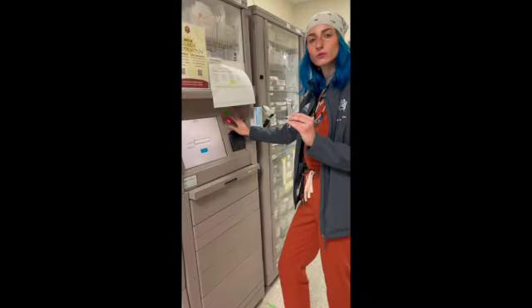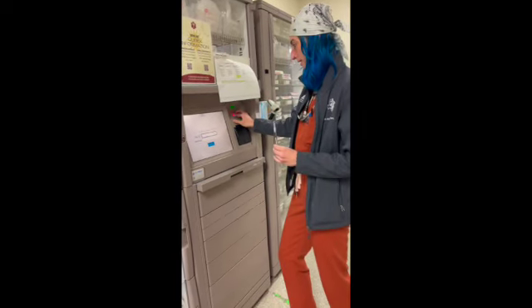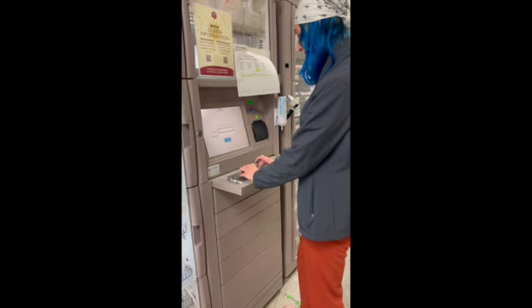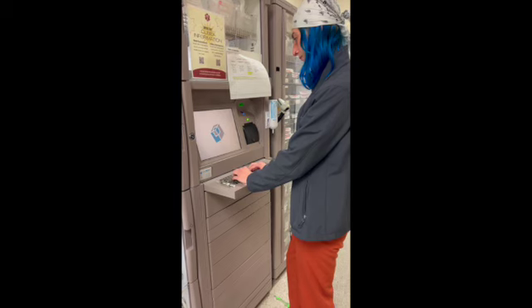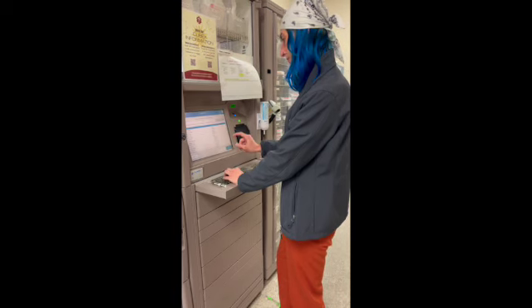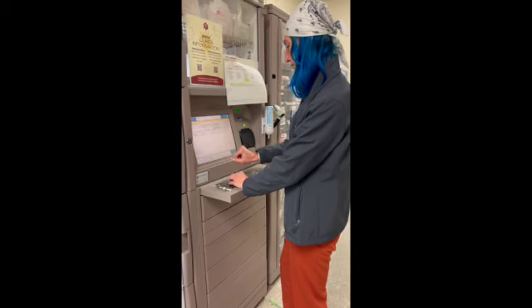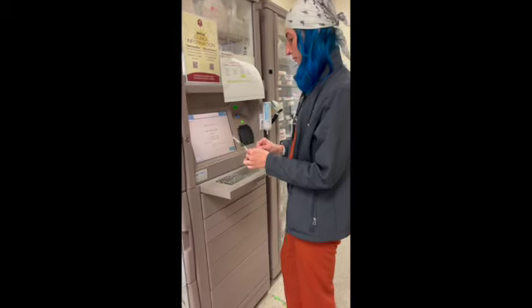So I am going to waste ketamine for our patient that did not need it. This is our Cubex machine. I'm going to sign in under my account. Now we're going to search for the patient's name and then the appropriate doctor that's caring for the patient. Then we will go to change waste, choose the ketamine that we're wasting, and have someone witness us.